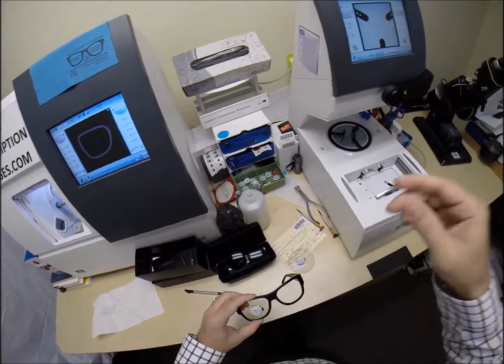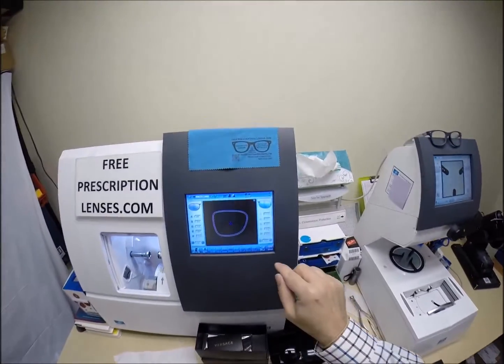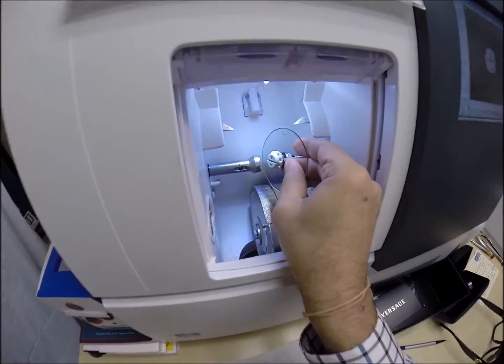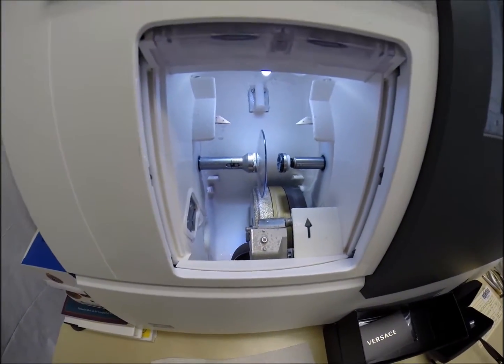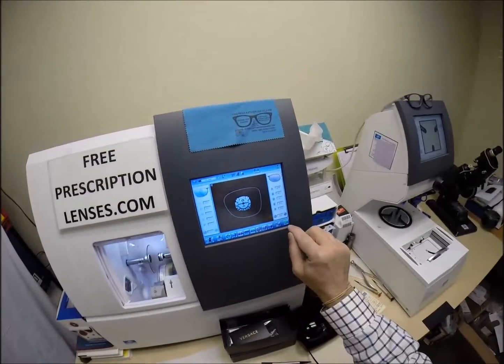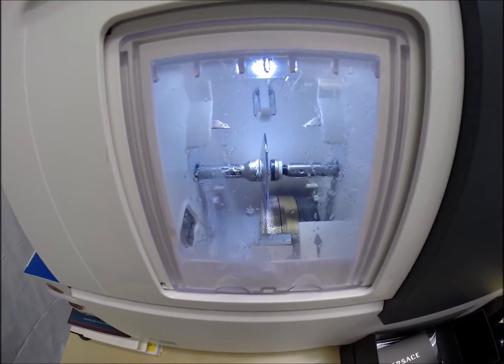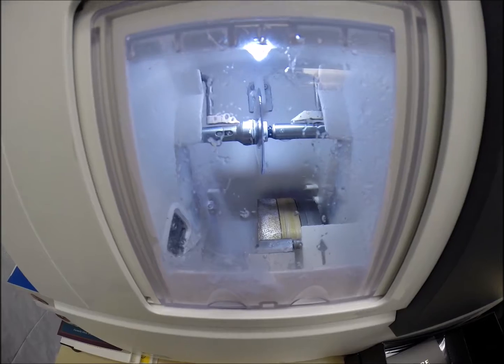Let's go ahead and start cutting the left lens. Okay, so we can grab the left lens, flip this over to L, press that on there firmly, place the lens into the chuck, the Chucky baby, the Chuckster, the Chuckarama. Let's see, and hit go. Just like before, the door is going to close, the clamp is going to shut, and then the lens is going to be traced by 2 white styluses, just like first time around.